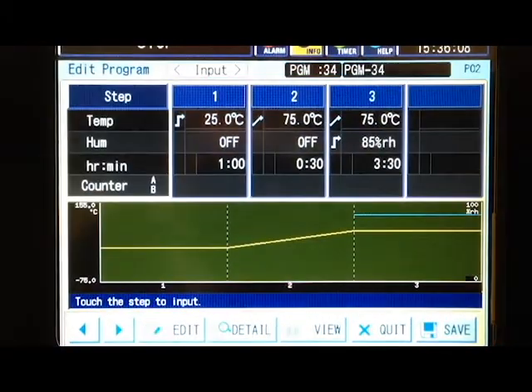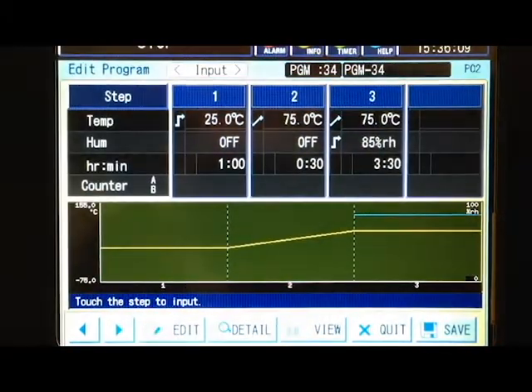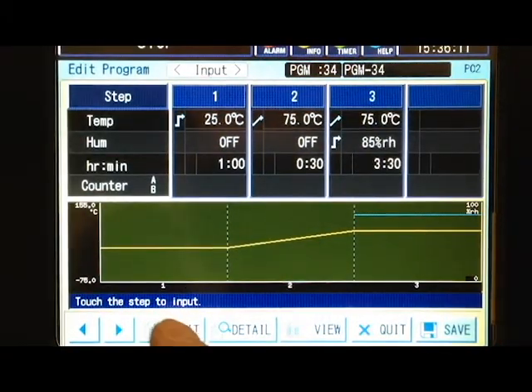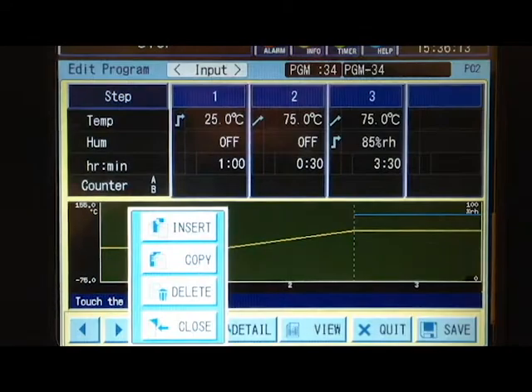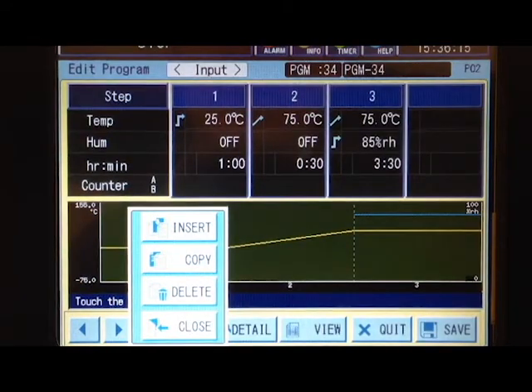Now we can see our three-step program in graph mode as well as what each step is doing. We can insert, copy, and delete steps.